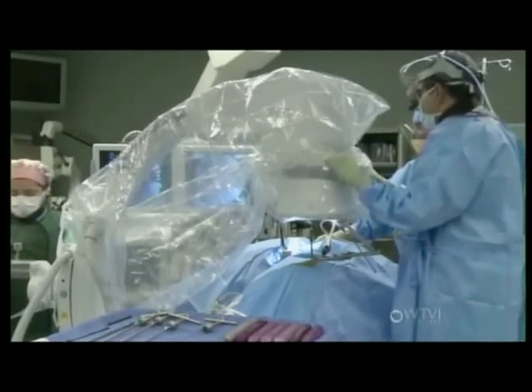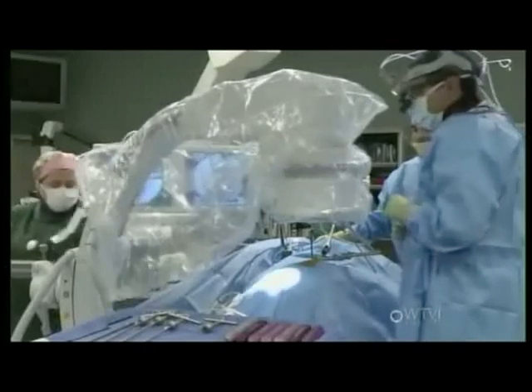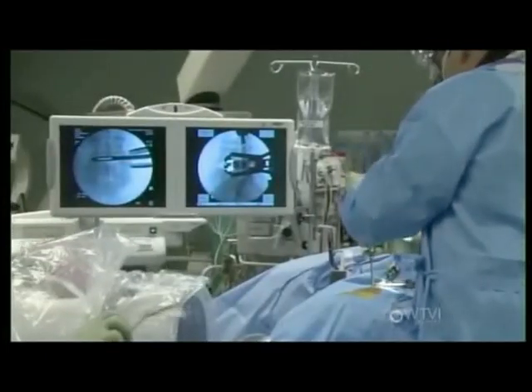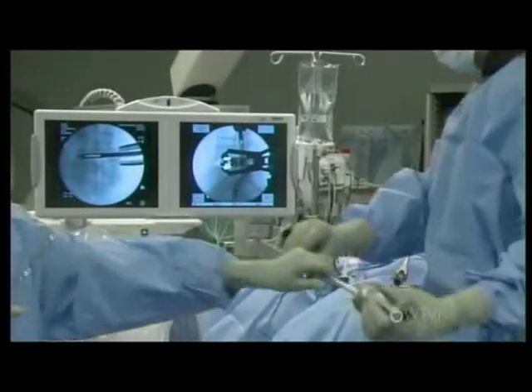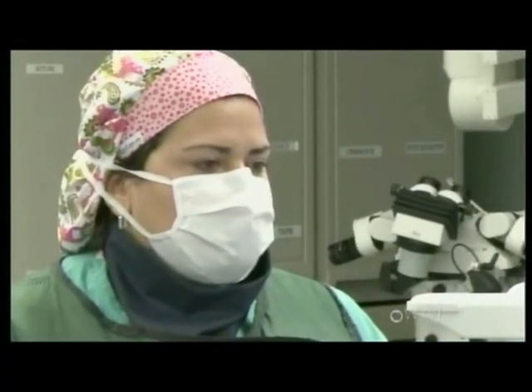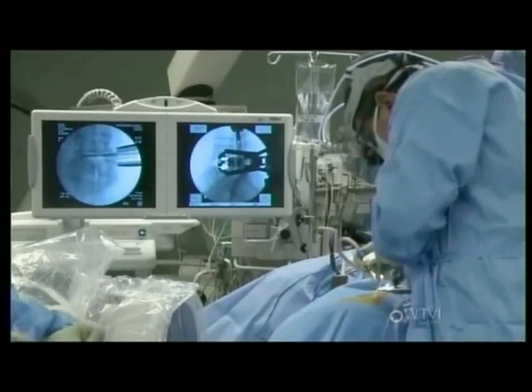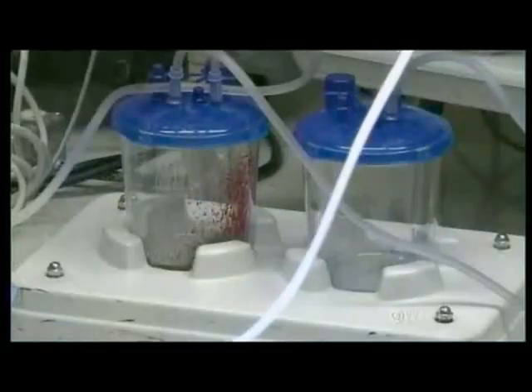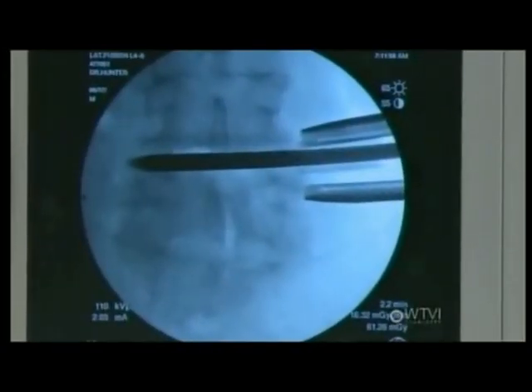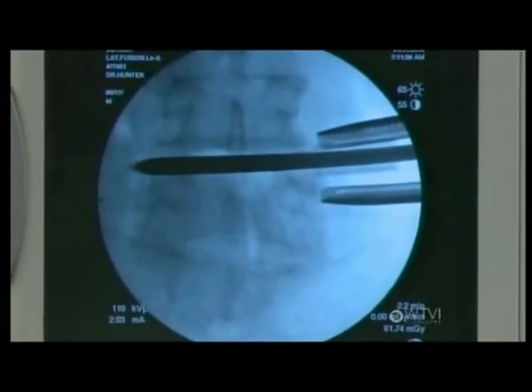That's a great picture there. Go back to the other side please — 90 and zero. Taking a tremendous amount of disc in there. So we're heading on down to the other side; we want to make sure we free the other side and break through that. And that's gone through — so now we know we've gone to the other side, no problem.